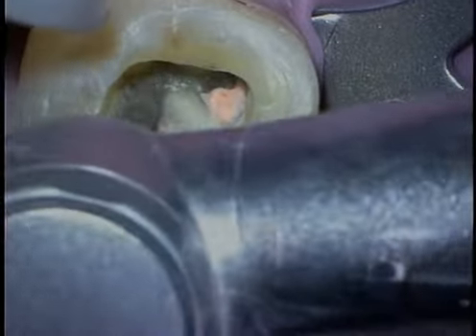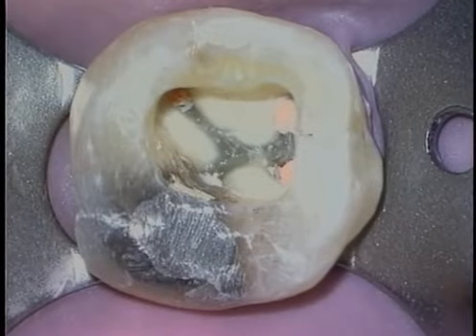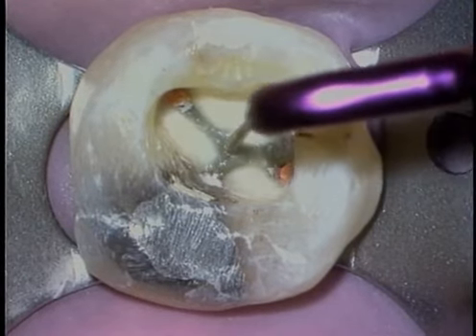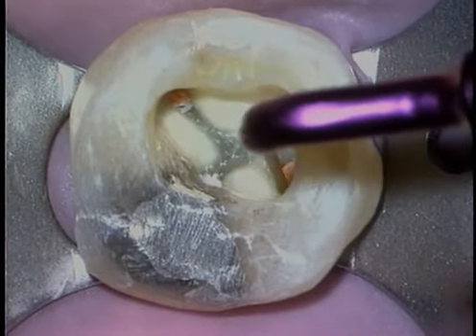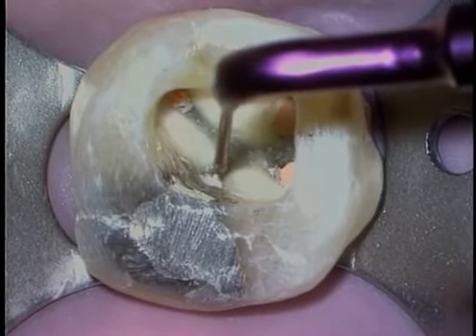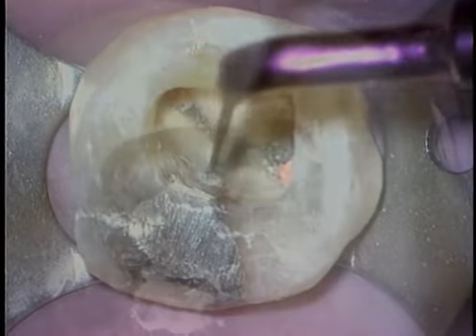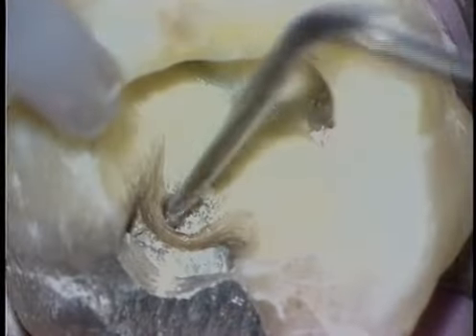Let's re-enter the tooth and check out the pulpal floor. The concepts previously described are important in terms of having smooth axial walls. Pulpal floors of furcated teeth frequently hold important information. Notice the dark organic lines that we can see moving between the gutta percha-filled orifices and something off towards the distal lingual. Ultrasonics can very easily sculpt away material, and you can see that we're already starting to move into a canal.